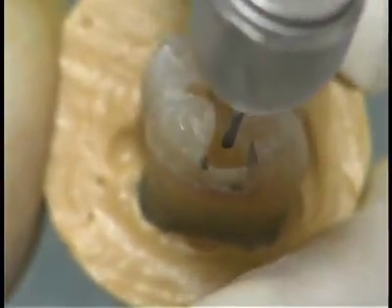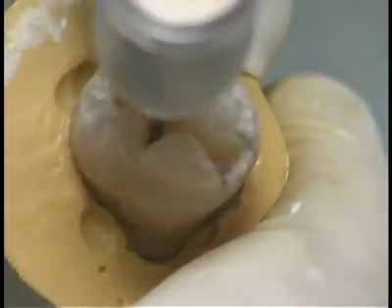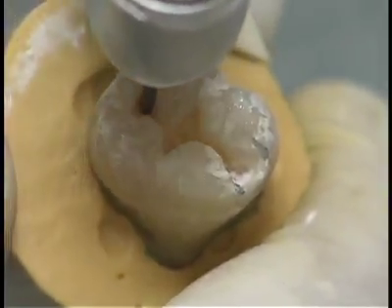Before dropping the box, the marginal ridge is thinned out as much as possible. This thinned out shell of enamel provides protection for the adjacent tooth and is also a guide for dropping the box.